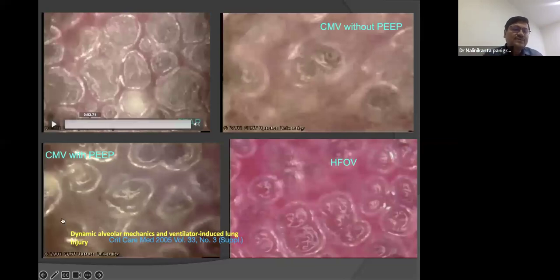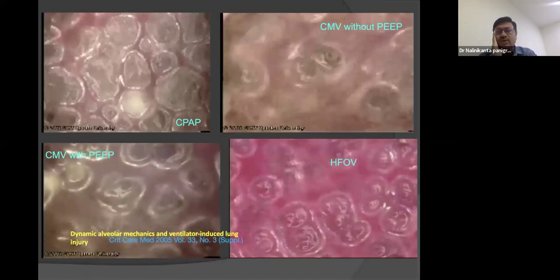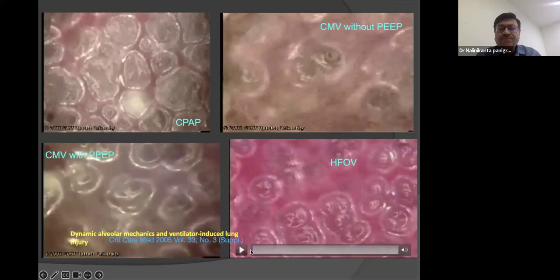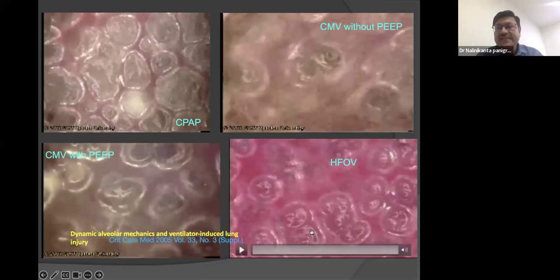How the ventilation happens, you can see it here. So it is a little better in comparison to zero PEEP or less PEEP when we are not recruiting the lungs. But still, the expansion and collapse happens here. But imagine, like the CPAP, the spontaneously breathing baby with CPAP, which should be our dream during positive pressure ventilation. But many times we have to ventilate.